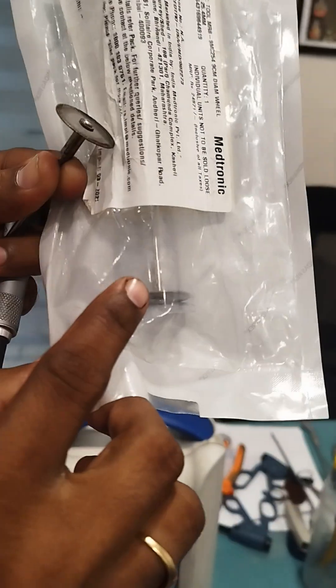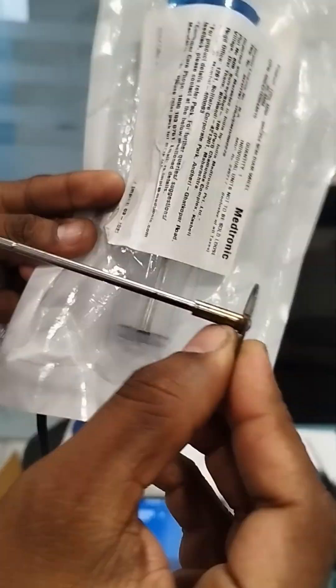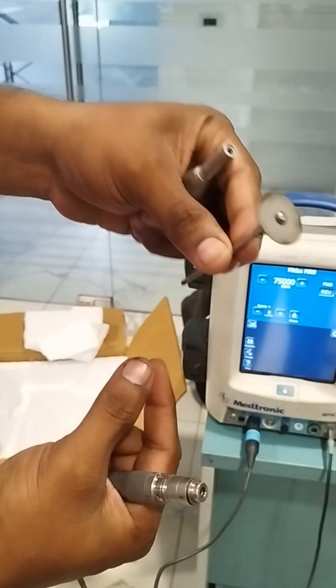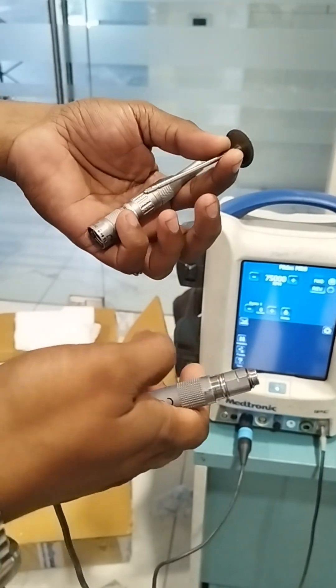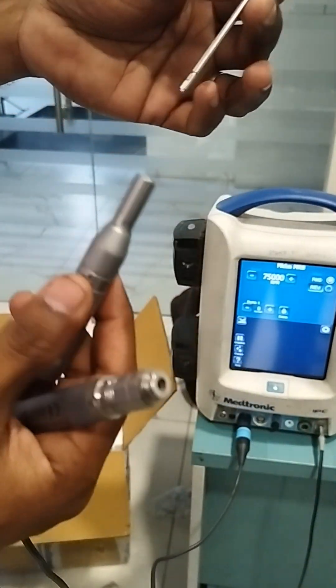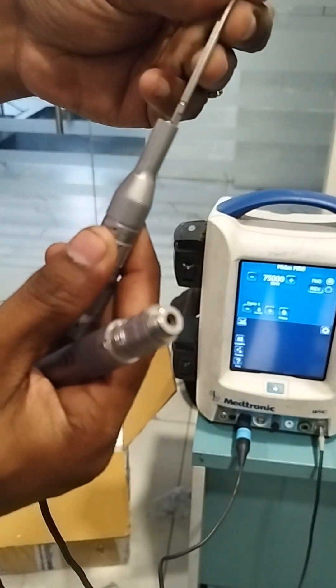The tool will be inside the pack like this. You can see a wheel kind of tool — similar to this — this is the metal cutter tool. So I am going to show you how to set up this metal cutter tool inside the motor. First, take the tool and put it inside.